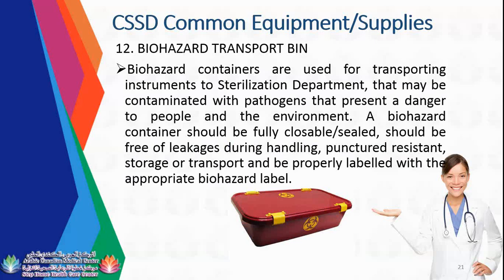This is your biohazard logo. It means that the instrument inside or any items inside is hazardous or infectious. So it has a lock to protect, if ever it will fall, the contaminated instrument will not contaminate the environment or your area.